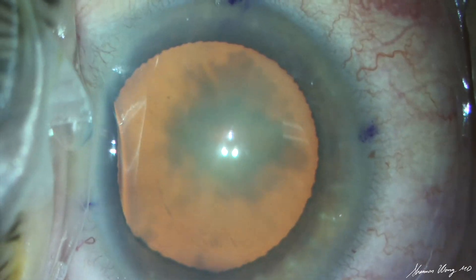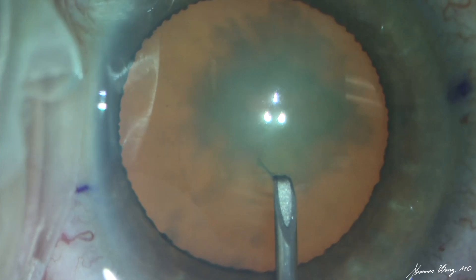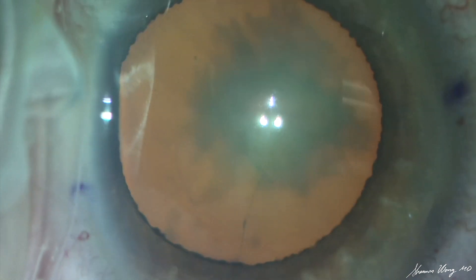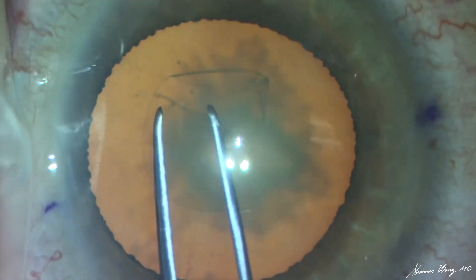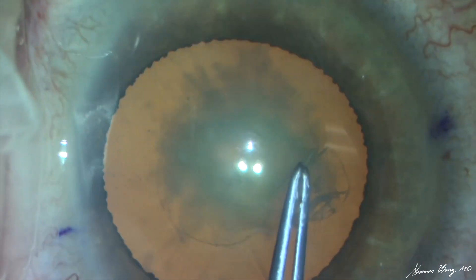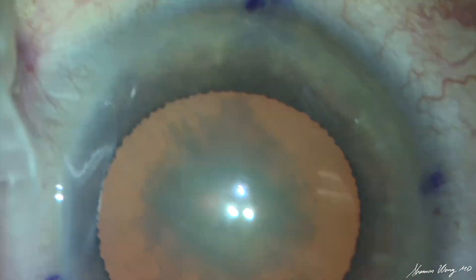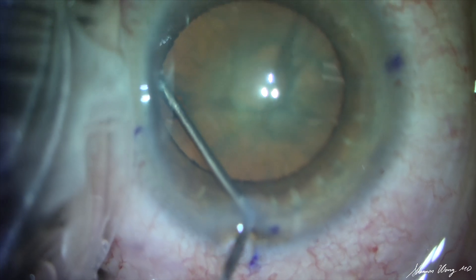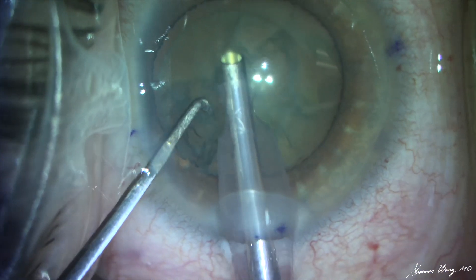The anterior capsule seems to move away from the cystotome when pressure is applied to create the initial opening. As we perform our capsulorrhexis, we note there is definitely less resistance to pulling on the anterior capsule, which results in a slightly smaller capsulorrhexis than usual. Hydrodissection is then performed.